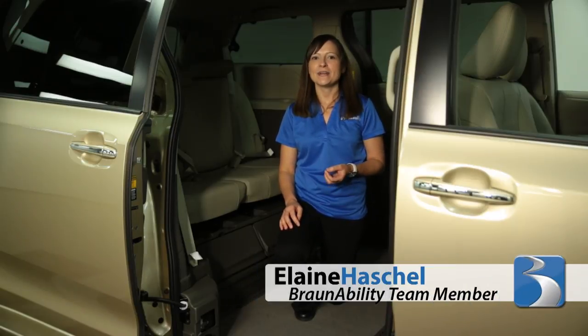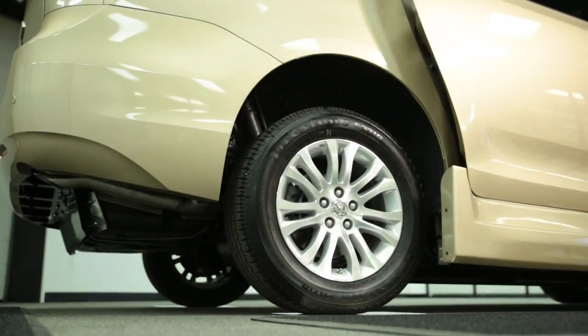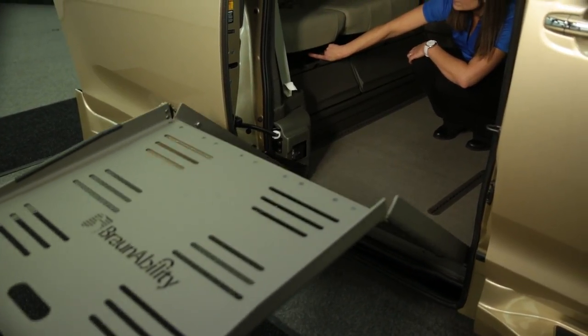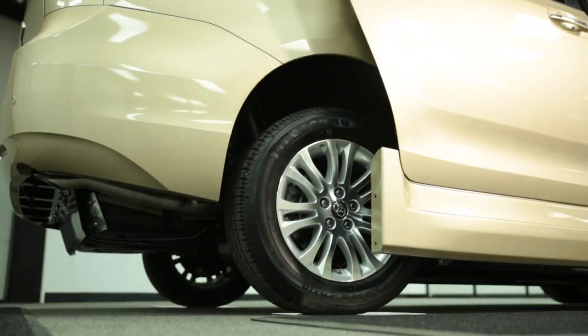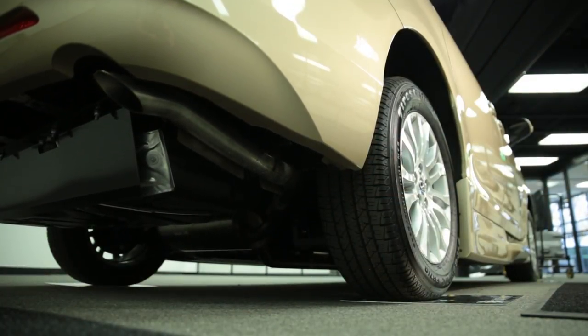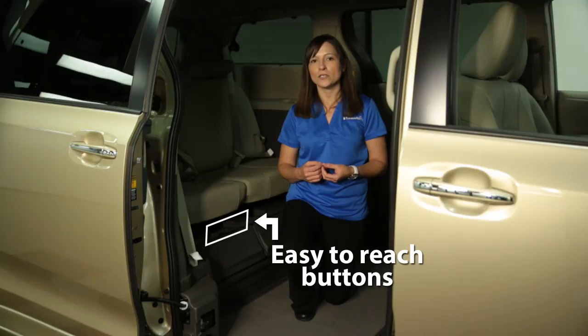Peace of mind is important. That's why we've developed a manual ramp and kneel override system, should you ever need it. One button stows or deploys the wheelchair ramp, while the other raises the van, allowing it to unkneel and return to a driving height. And of course, they're easy to reach for a wheelchair user or passenger.